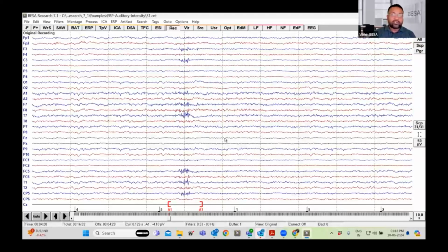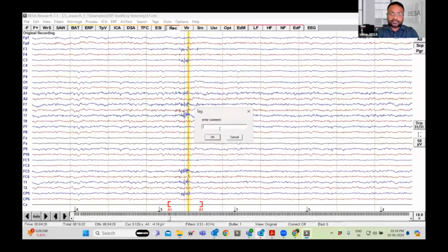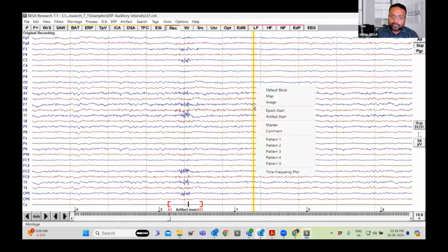Next, one thing I wanted to show you is how you can add comments and markers to the data. Suppose you want to add a certain comment at this point. You can just right click over here and comment it as artifact in the tag that comes up. Now, if you want, you can go to this event log. For some reason I don't see this. If you have these comments and events already embedded in the data, it should be available.